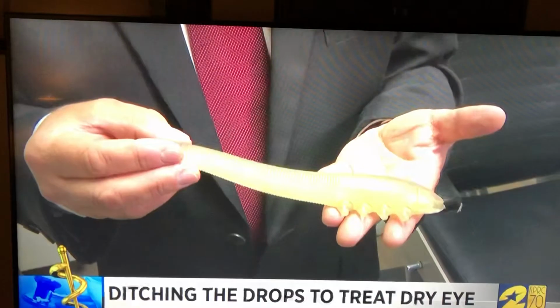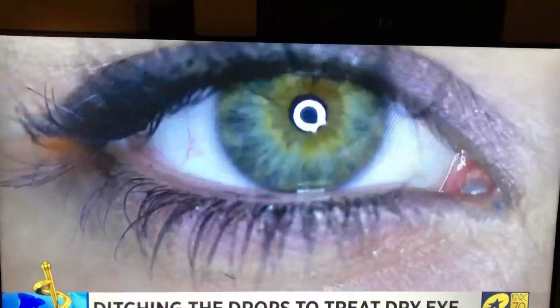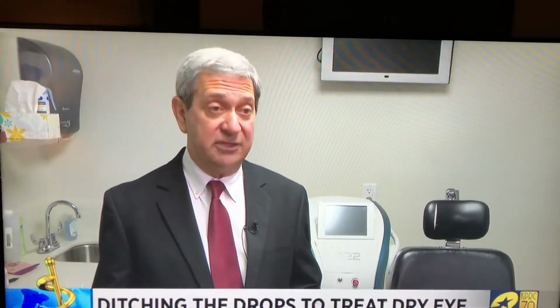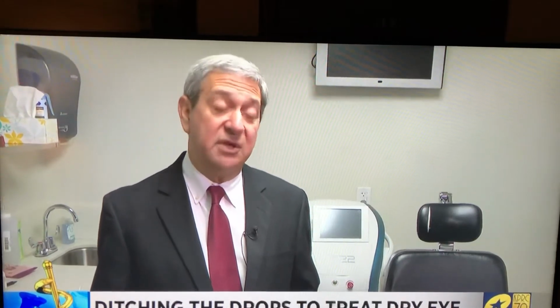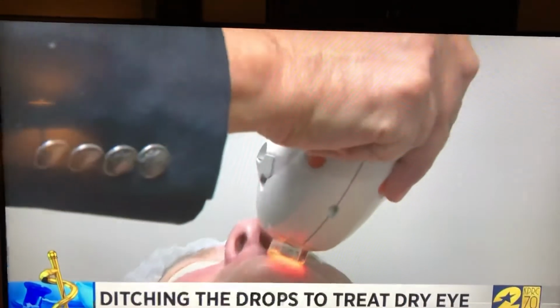And if you weren't too keen on this treatment just yet, he says you will like knowing that IPL also kills tiny microscopic bugs called Demodex that live on your eyelids, and if there are too many, could make your life miserable. The other thing you're doing is decreasing the number of mites that live in your skin. These are normal, they're symbiotic mites, but too many of them will plug up the glands. And so this light seems to kill them.